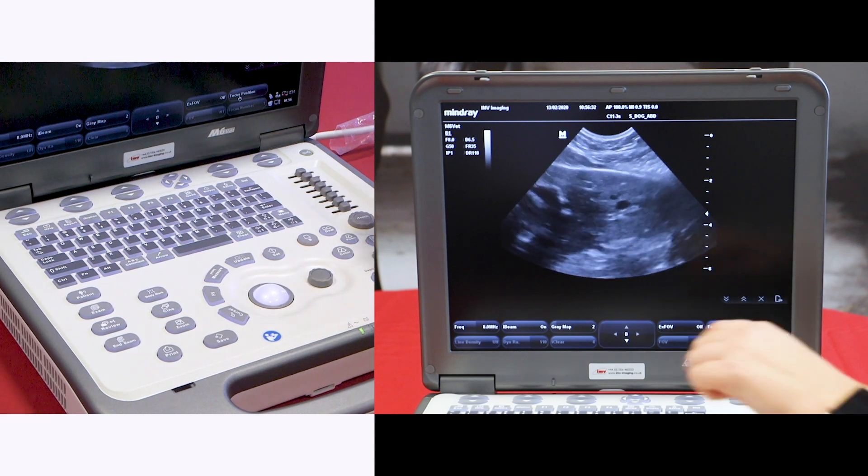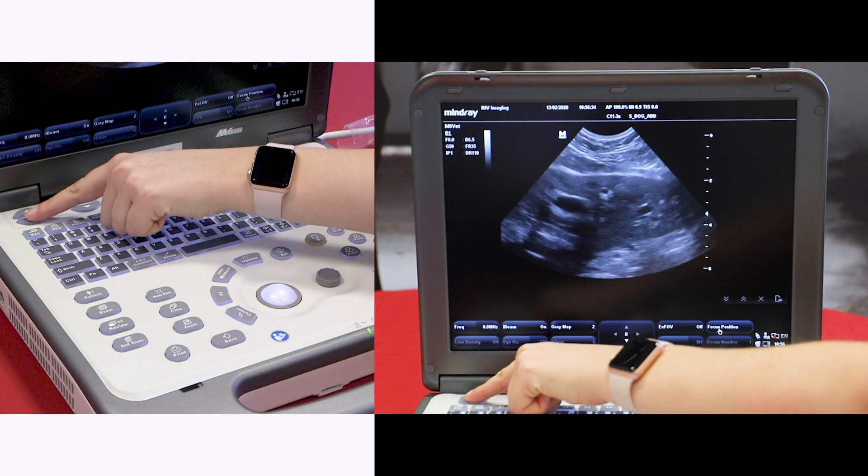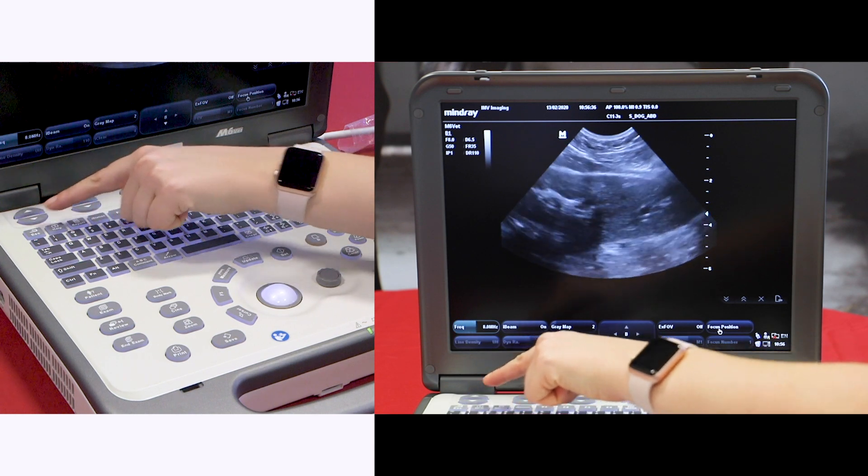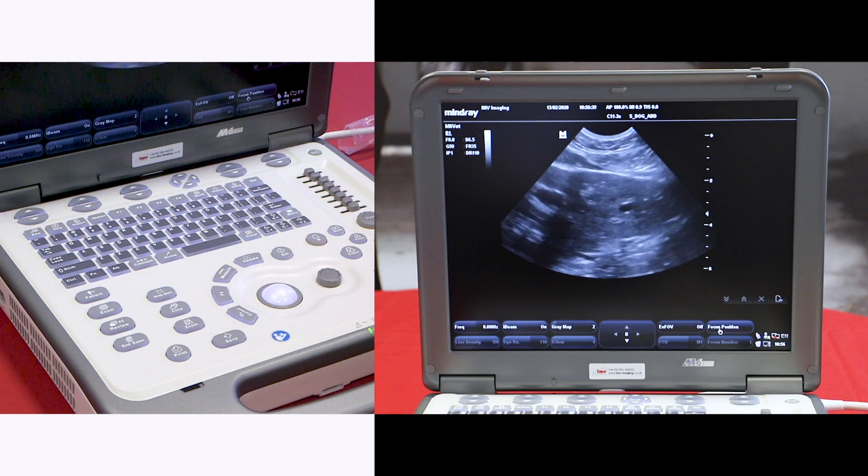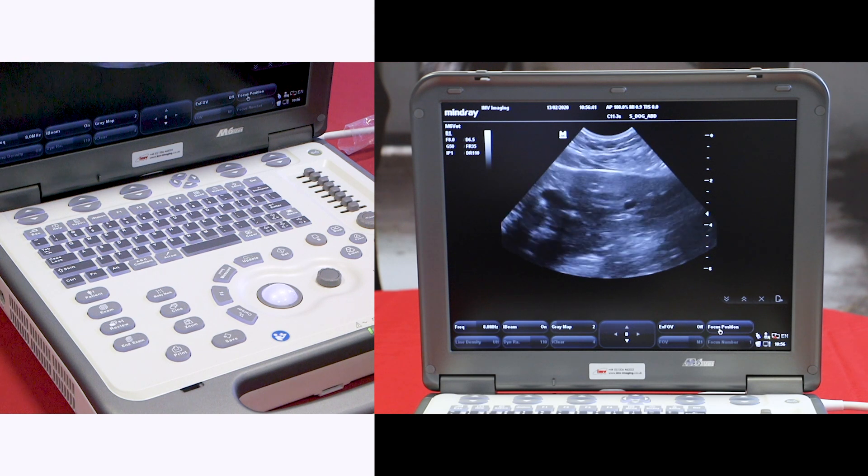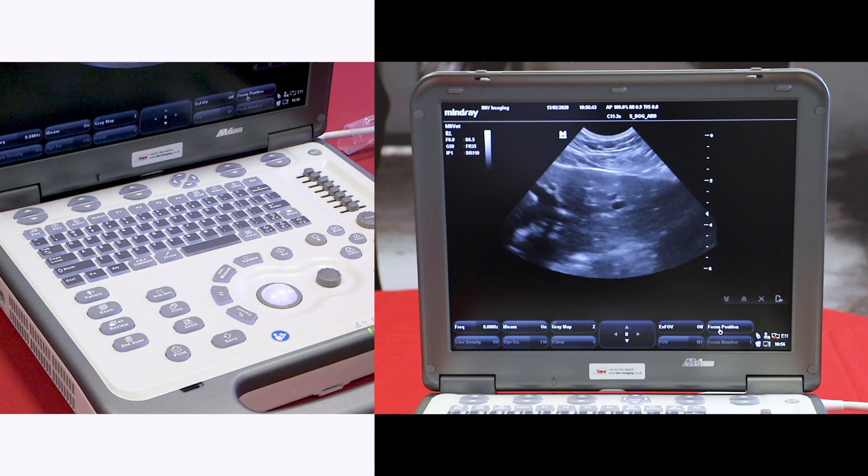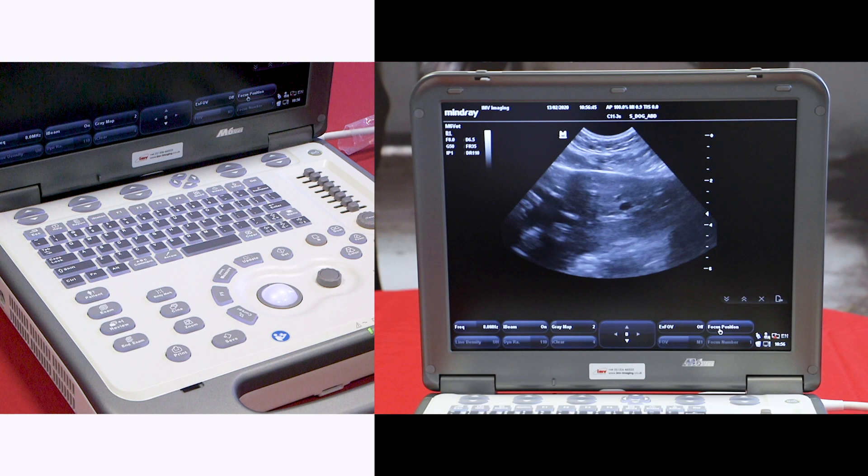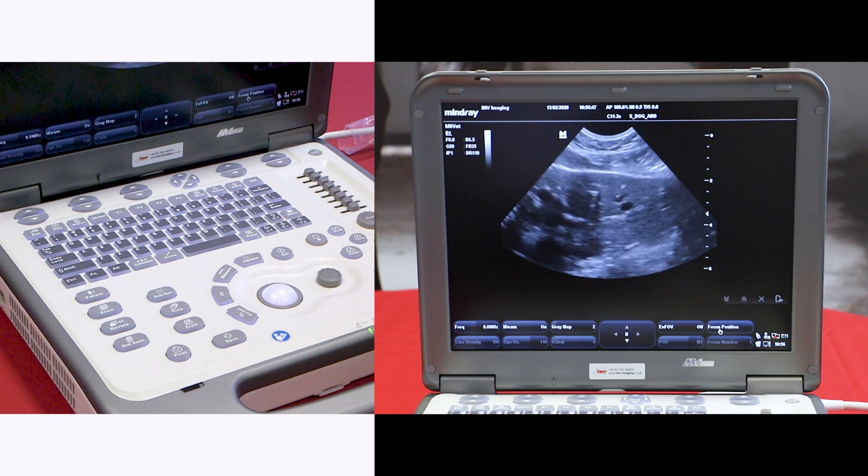The frequency can be adjusted with these buttons here. The higher the frequency the better the resolution of the picture but the lower the penetration. Always try to use the highest frequency you can get away with for the level of penetration you need.